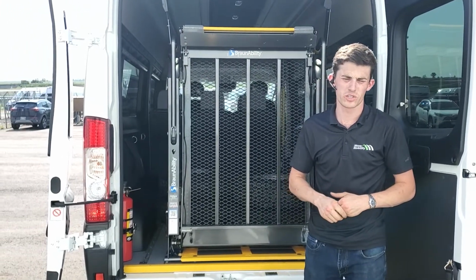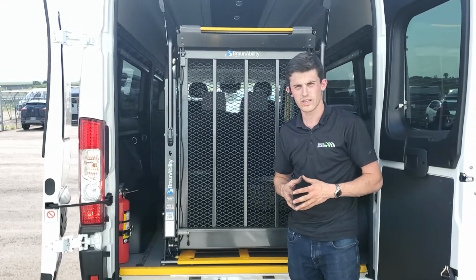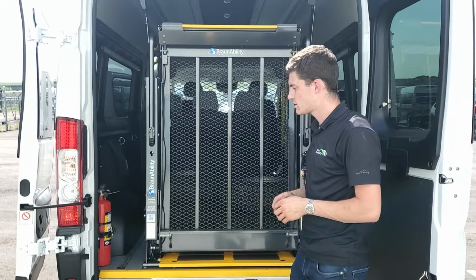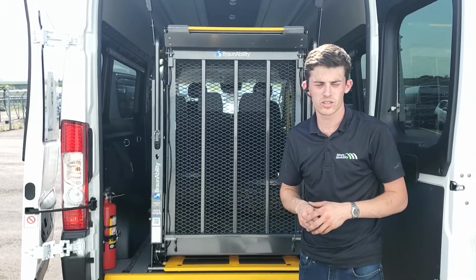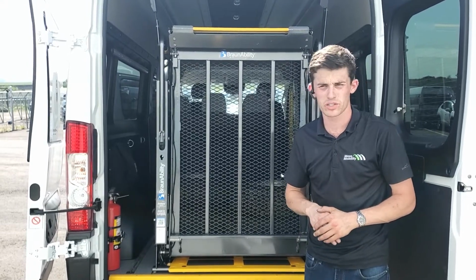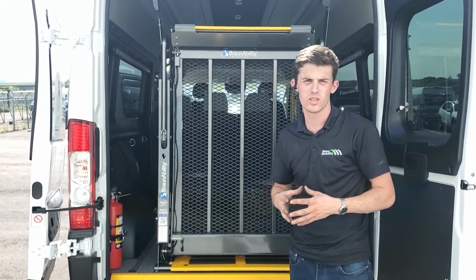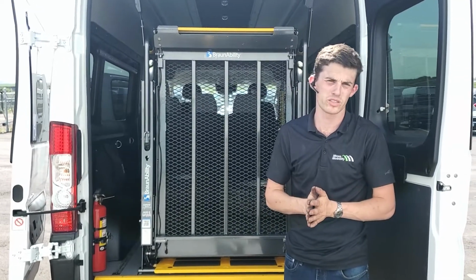around your organization. It's less than a 5-minute phone call with your handyman or service technician, and you just need a few simple tools, a socket wrench, and an Allen key to increase that pressure. Again, please call in to our service department, and they'll be more than willing to help you with that.